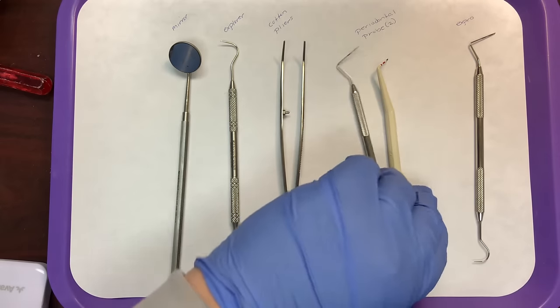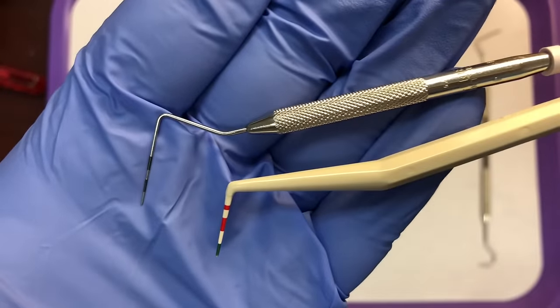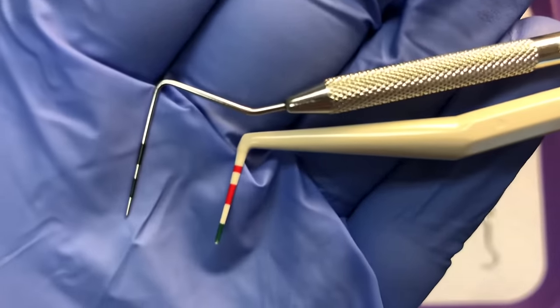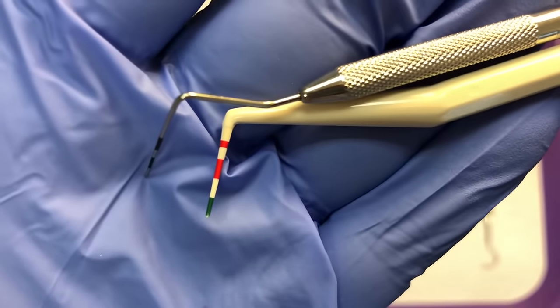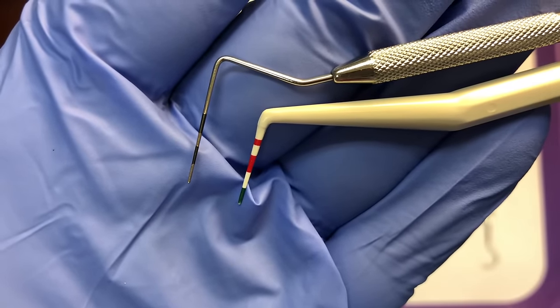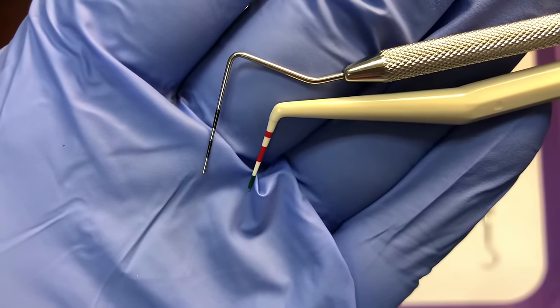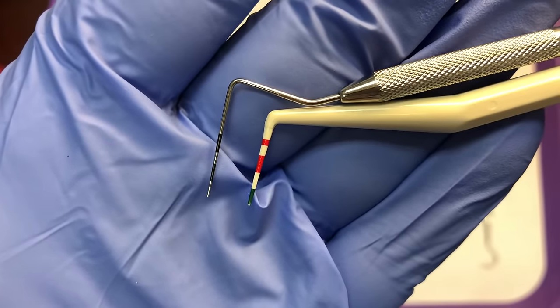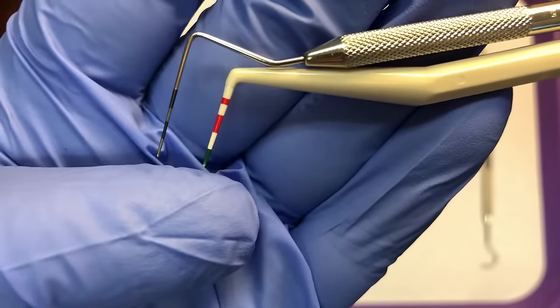We have two different periodontal probes here — one plastic and one metal. If you notice, they both have stripes on them. The tips are blunt, not sharp like the explorer. The purpose of this instrument is to measure the sulcus. The tips go into the sulcus, and we don't want sharp tips because they could pierce or puncture through the soft tissue.